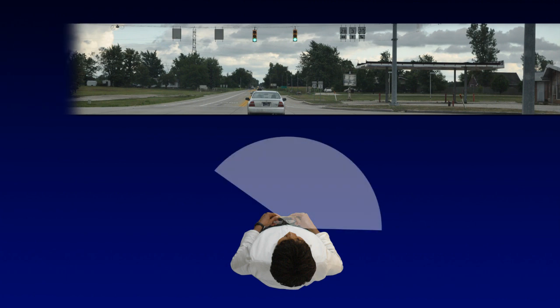Here is the visual field of the right eye. Notice the right eye visual field can see not only 90 degrees on the right side, but also 45 to 60 degrees into the left visual field. This gives the patient a total of 135 to 150 degrees of field.